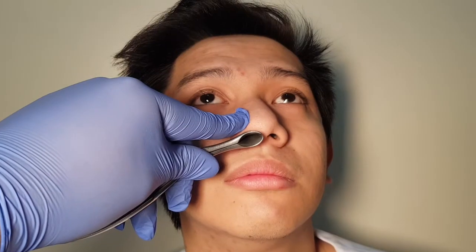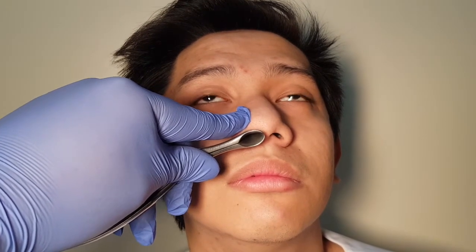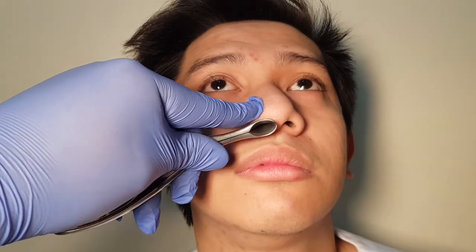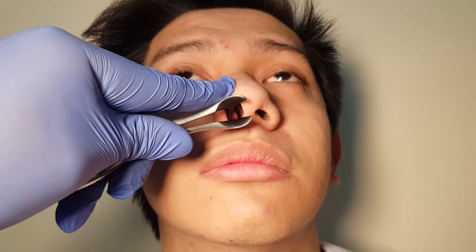And then, we will insert the nasal speculum into the nasal vestibule. What is important here is that the nasal speculum should rest against the alar of the nose, not the septum, because it can cause pain. When the speculum is inserted and resting against the alar, pushing it slightly outward, it can be opened slowly without causing the patient any discomfort.